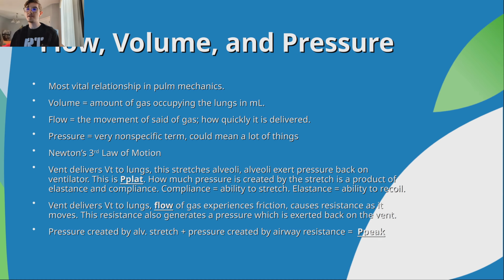Now here's another thing, all right? So the vent delivers a tidal volume to the lungs. That flow of gas experiences friction, and that causes resistance as it moves.